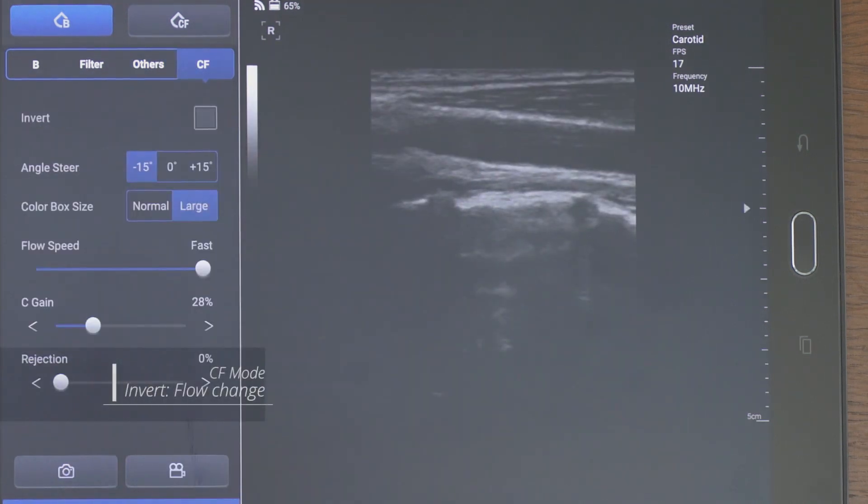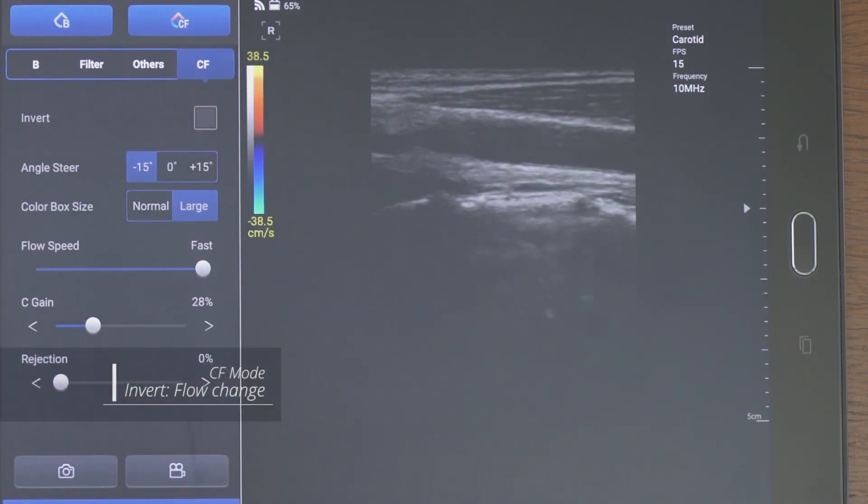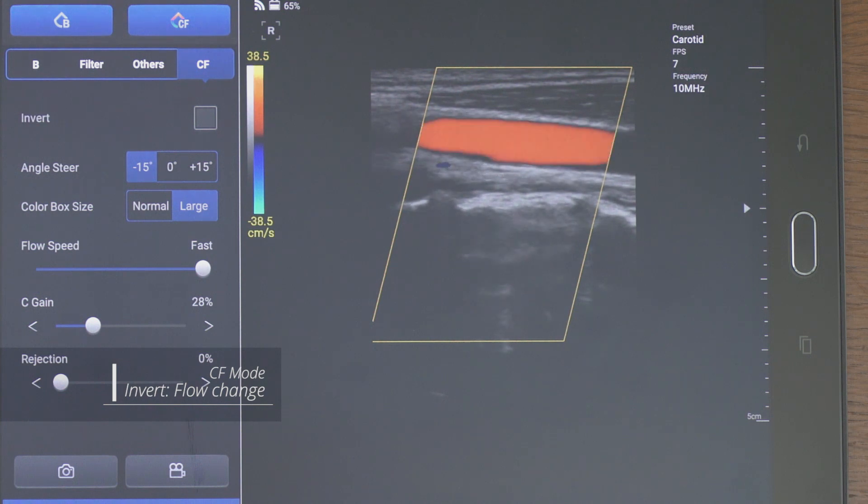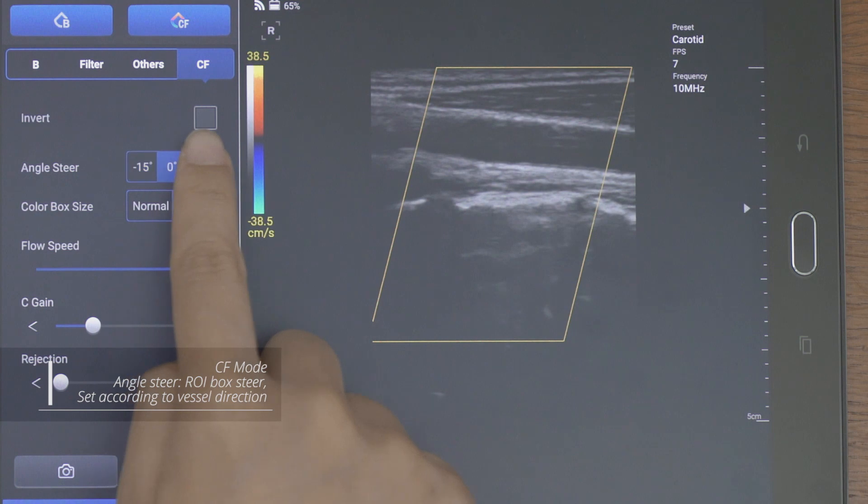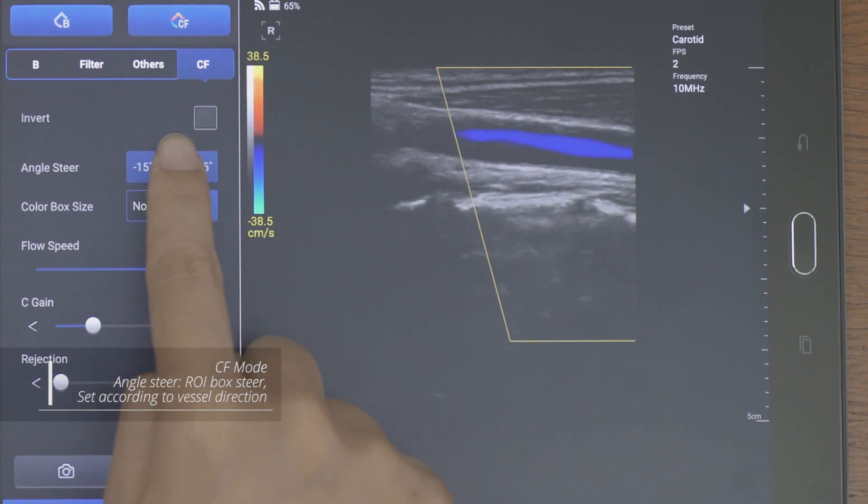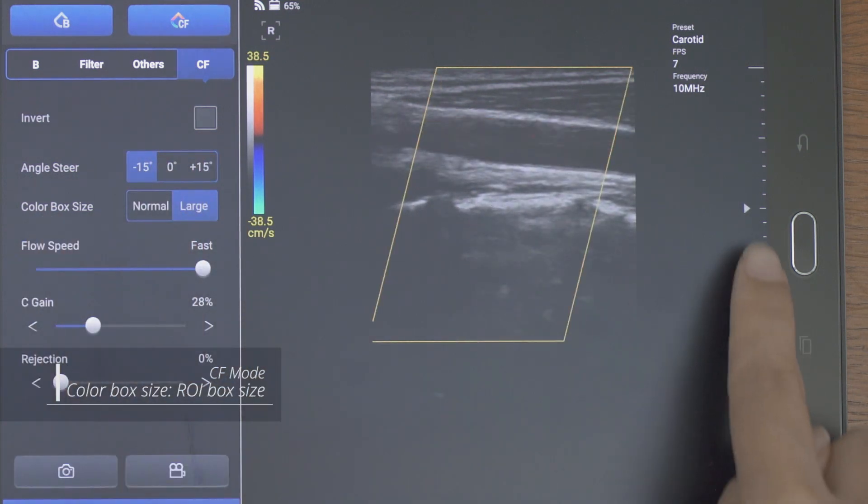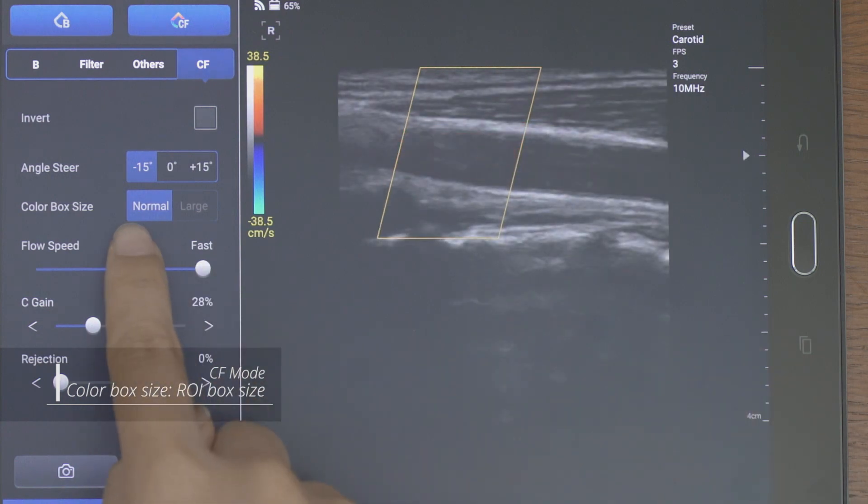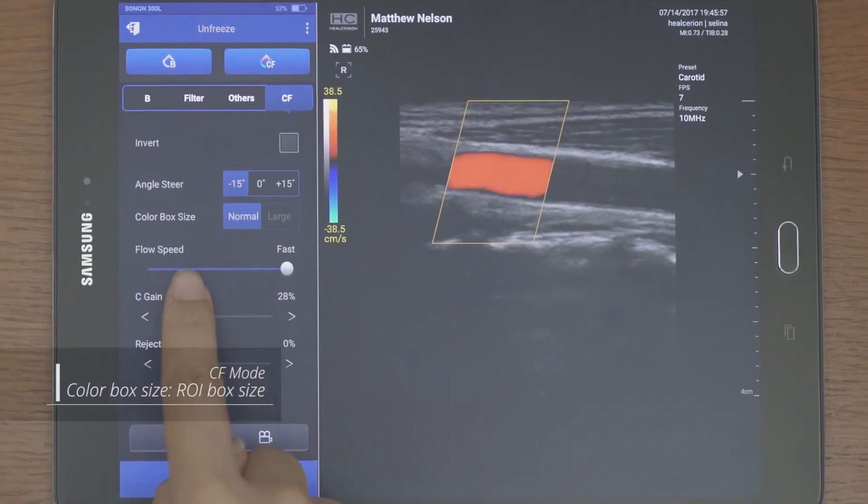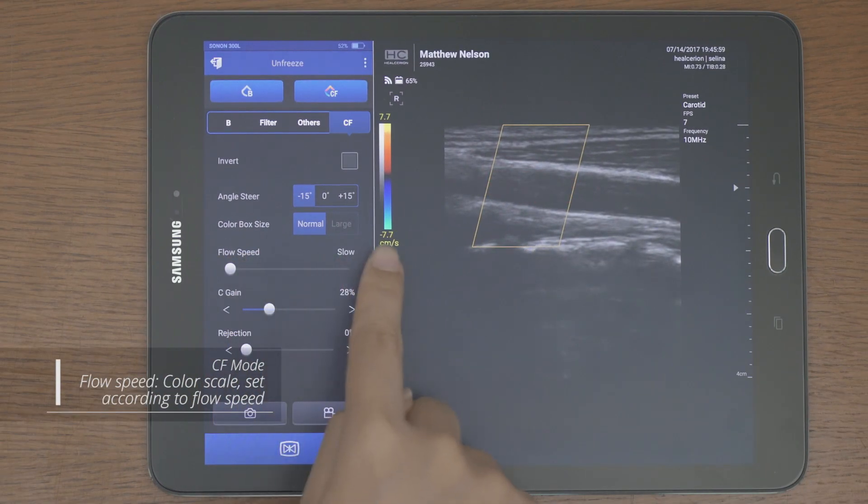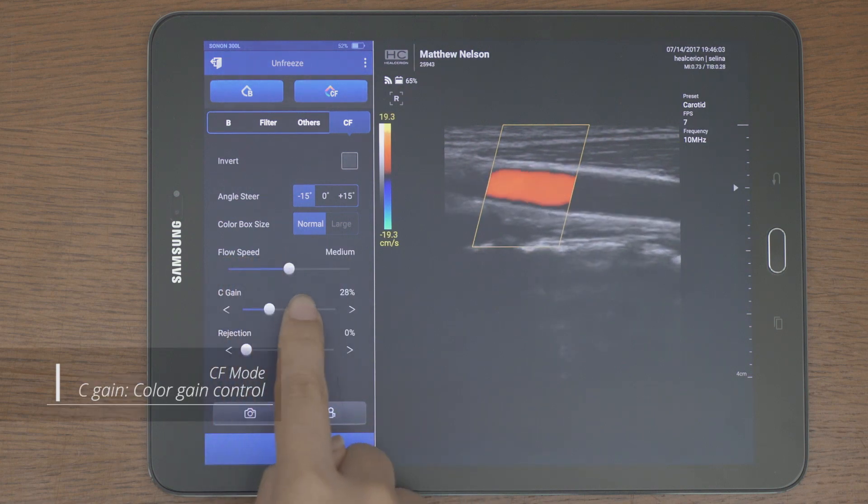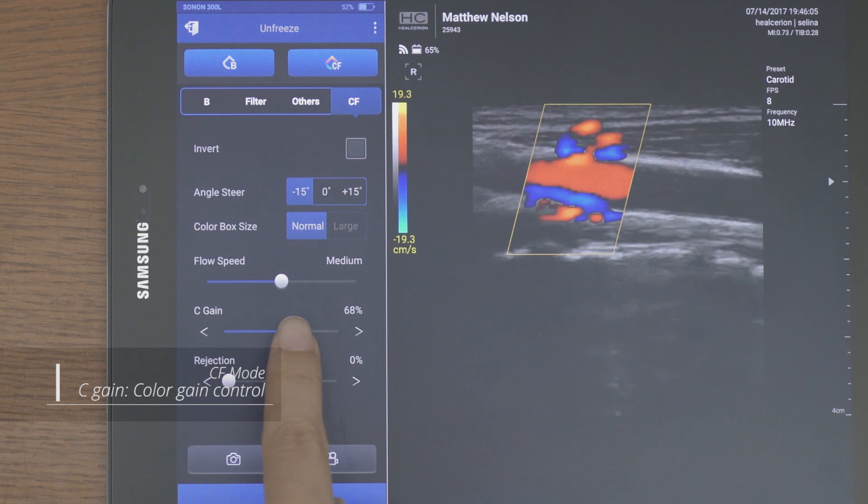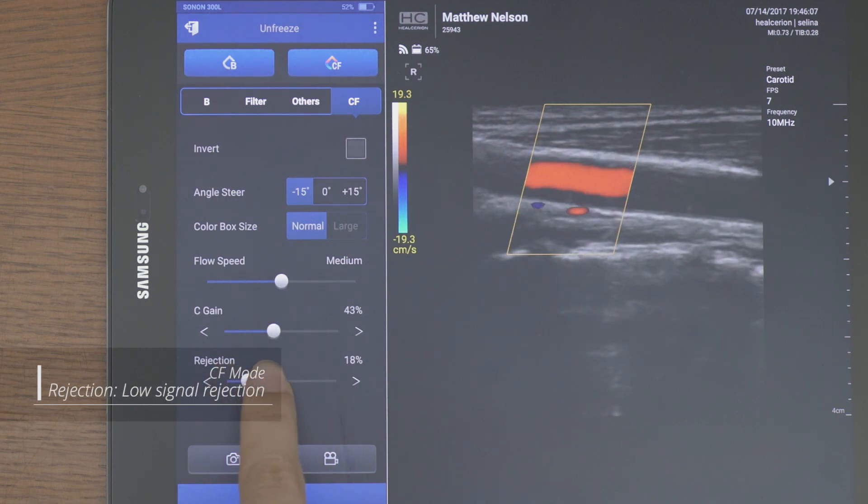In CF mode, you can adjust the invert, angle steer, color box size, and PRF scale in flow speed. C-gain and rejection can be adjusted too.